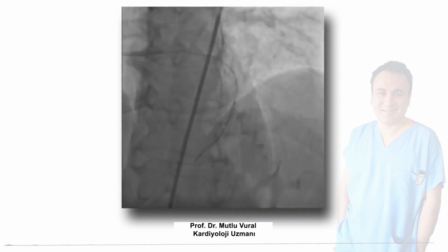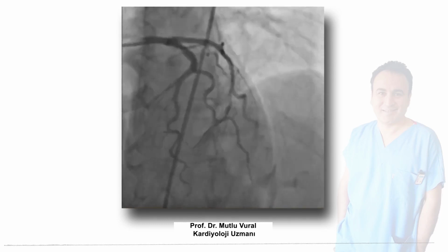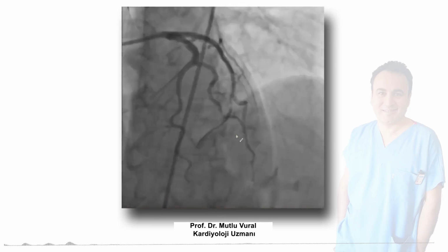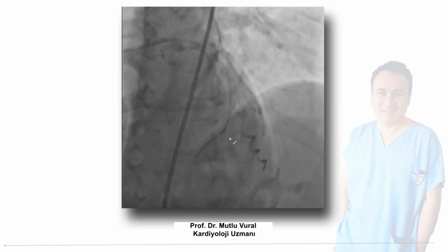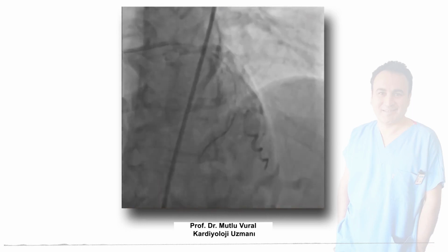Now this is predilatation. You see, distal 1/3 of the balloon is not dilating. You couldn't reach high pressure. You shouldn't do that. And this is rupture now. Flow in the OM branch is decreased.